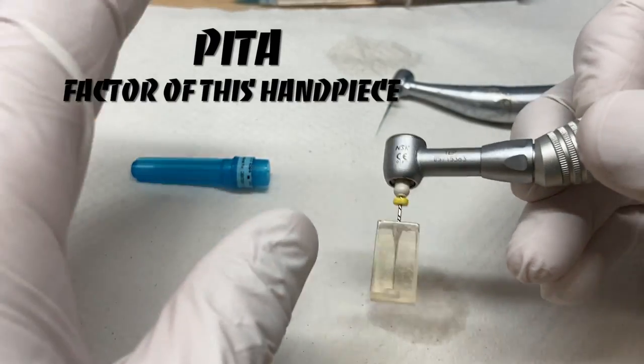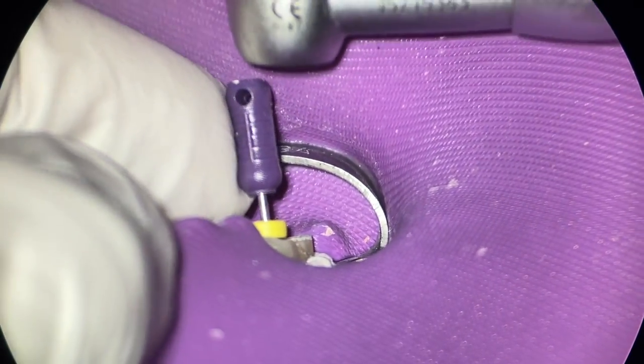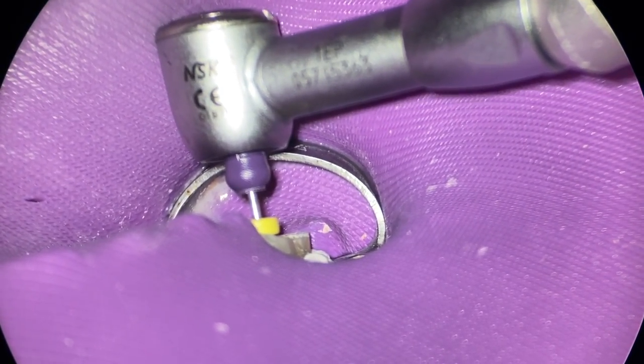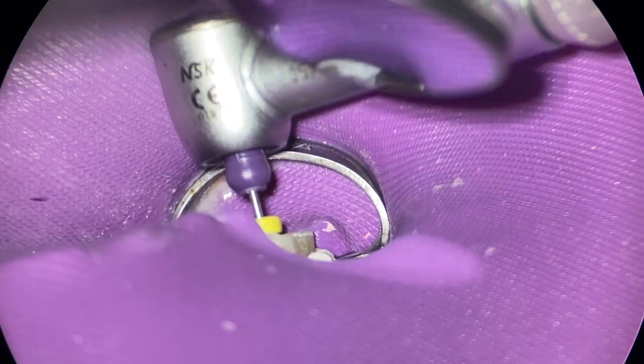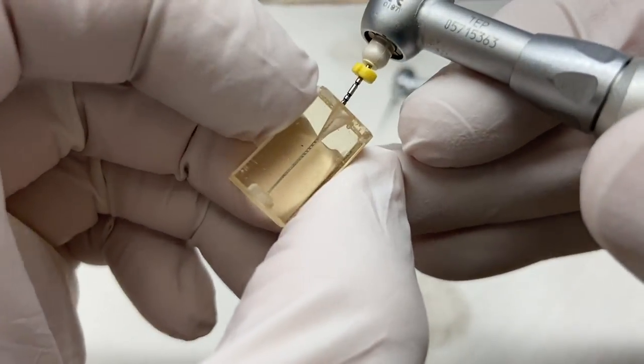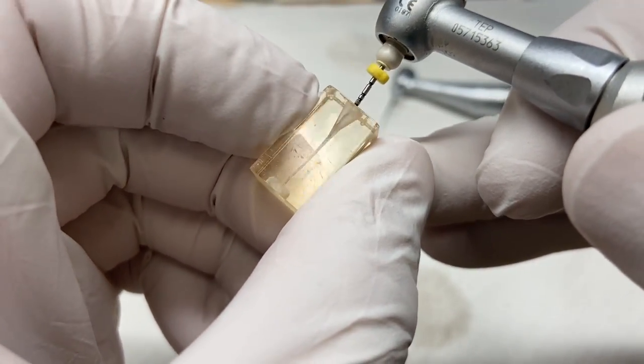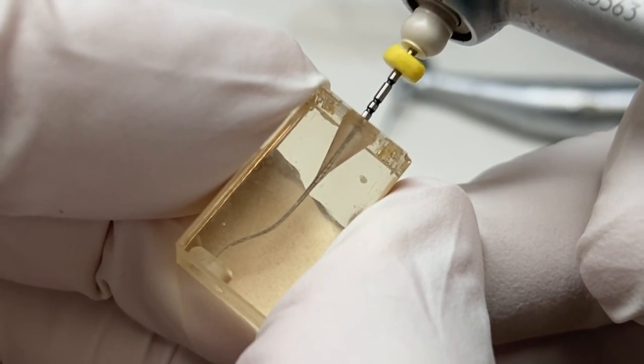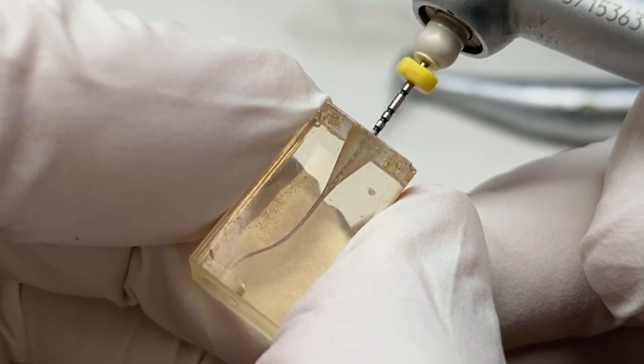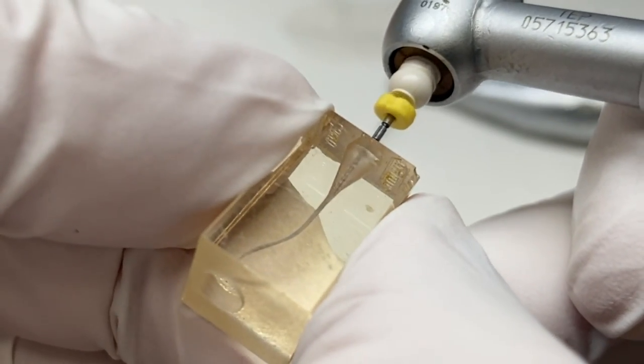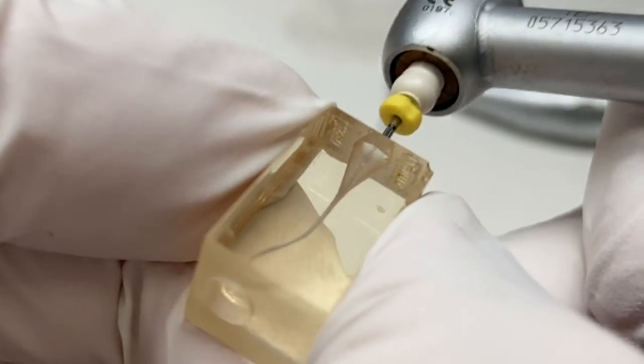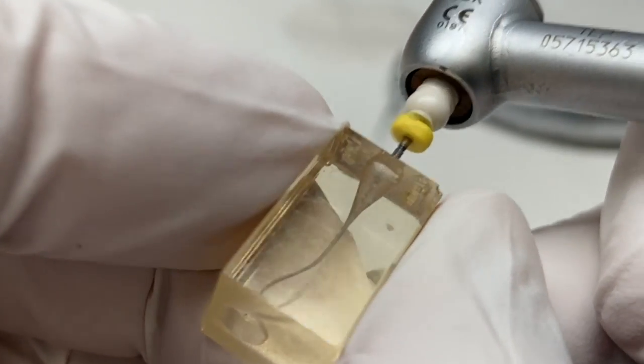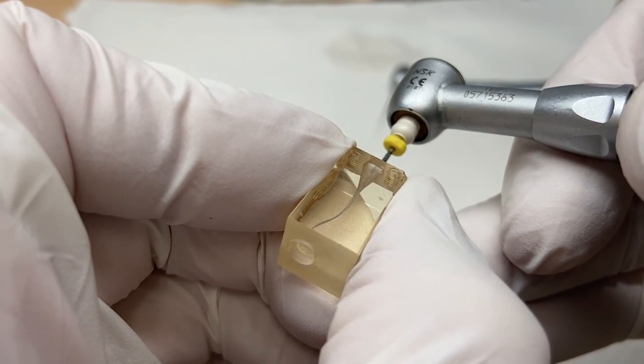So what we're going to do is, a difficulty in using this handpiece is you have to put the handpiece on the file while it's in the patient's mouth. So it makes it a little more complicated. And then we just hit the gas pedal. And what it does is it essentially watch winds that file back and forth. So what I'm going to do is I'm going to move that up and down just a little bit, and we're going to keep it outside the tooth, just a hair, one red bar.